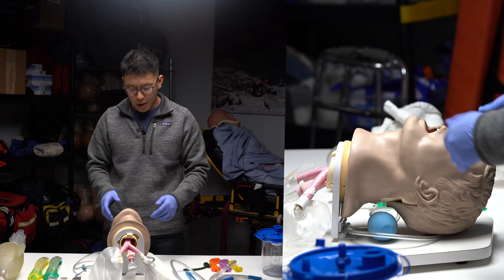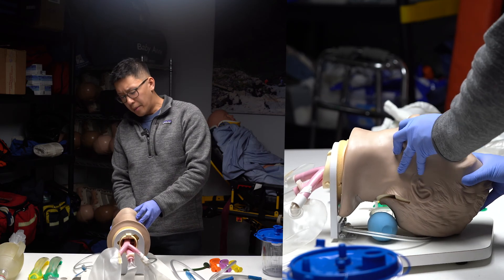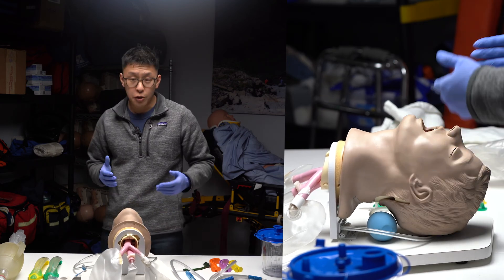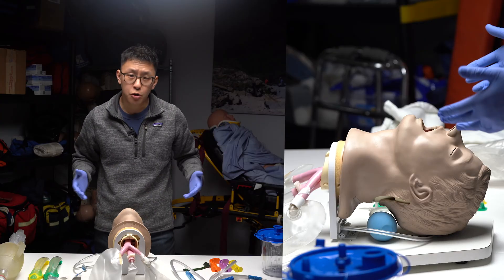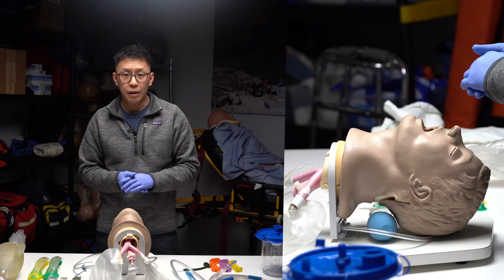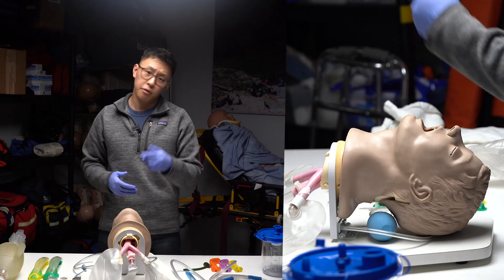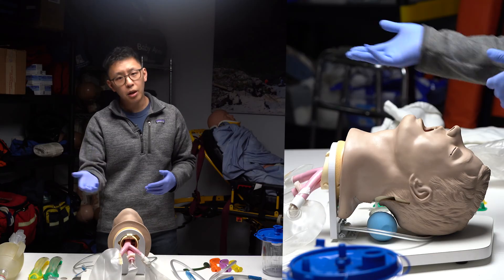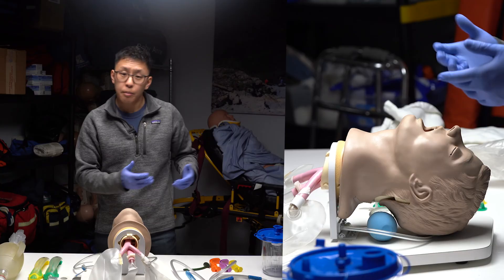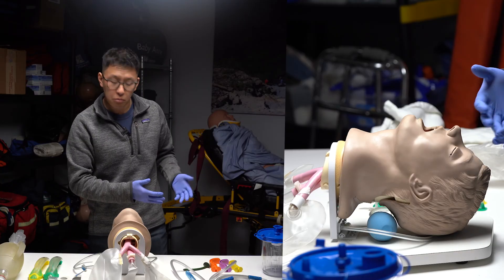Next, perform a head tilt, chin lift. At this point, visualize for any obstructions in the airway. The proctor will tell you that you have vomit, blood, or secretions in the airway, and you're going to be prompted to provide suction.